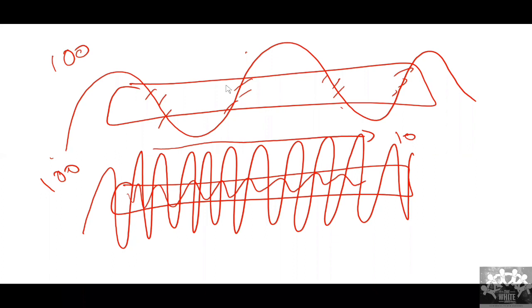So we might see the reflection of sound coming from all the places, even including the deeper area. Whereas in case of the higher frequency, the reflection of the sound will be seen only from the superficial area. As it goes to the deeper areas, there is no sound to reflect back. So that's why it is important to know the difference between a low frequency as well as high frequency.